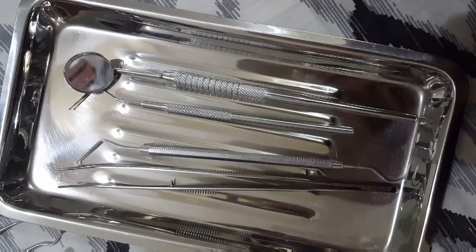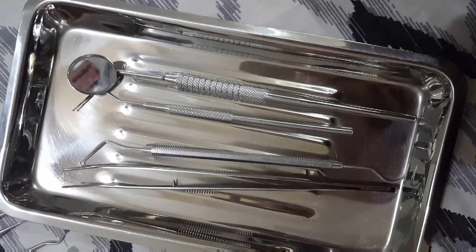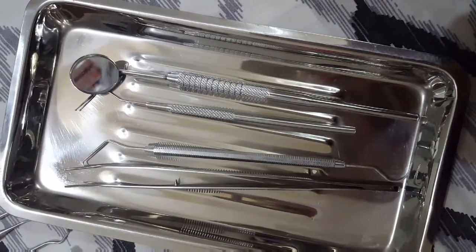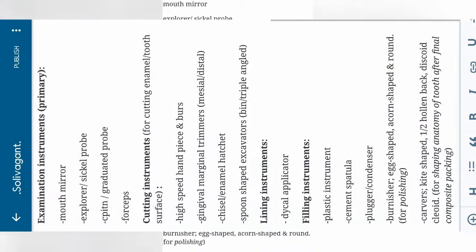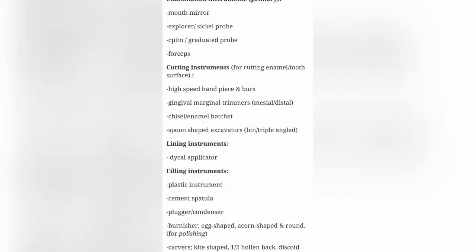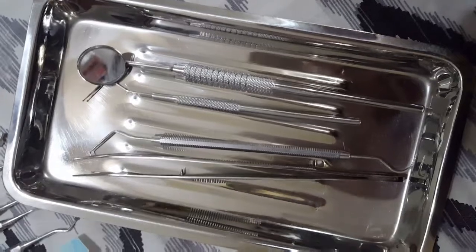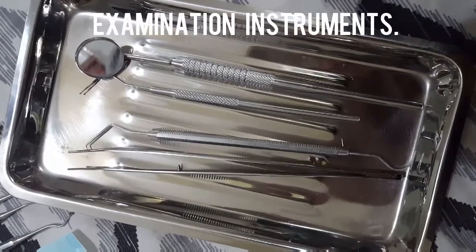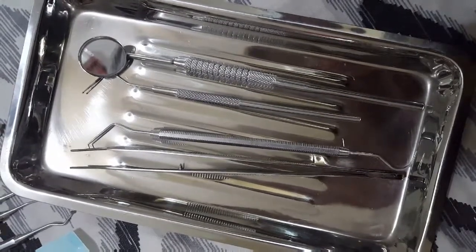Okay, so I'm here informing you about the hand instruments which are commonly used in a dental composite filling in our average dental clinic. So here's a list of instruments which you can also find on my WordPress page. First of all, I would mention the primary instruments, which are our examination instruments, which are usually used in the examination as well as along with any other dental operative procedures.